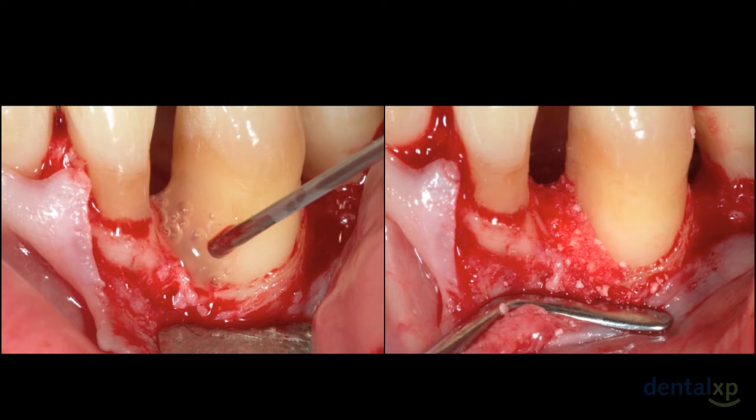I have now placed the BioOss collagen in place. You'll notice how beautifully it conforms to the defect. I can pretty much tell you that when you put it in this way, it will stay there. But it's always great, as I said, to have primary closure.